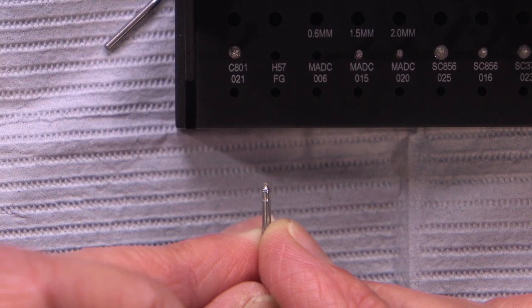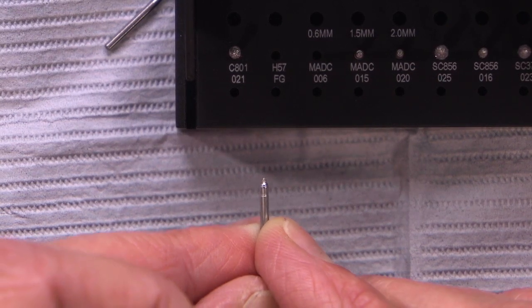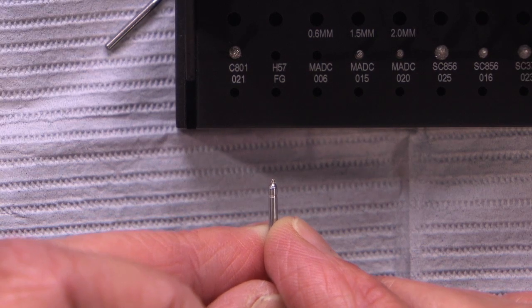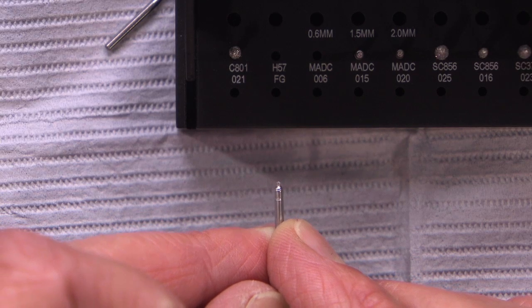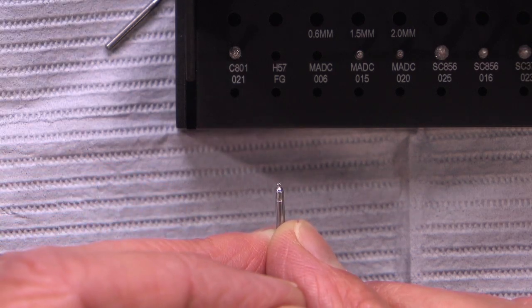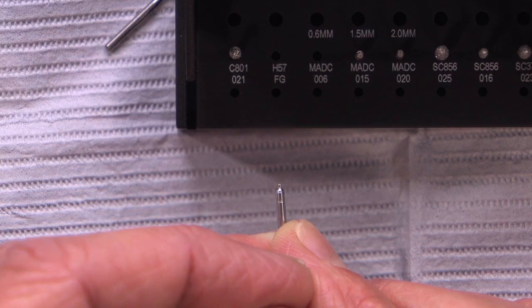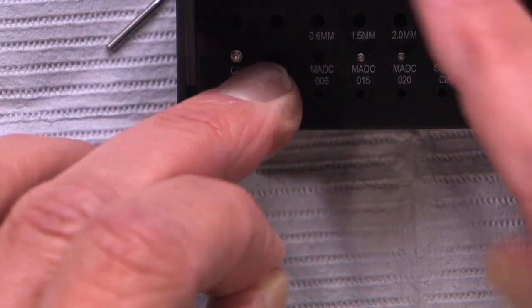So if I'm doing a Bruxer crown on a lower second molar, I'll use this burr to put a depth cut on both lingual cusps and then two in the central groove, maybe even the buccal cusp too, because on a second molar that can be difficult to see. And then I'll prep the occlusal surface till I can't see those depth cuts anymore. And then I know I have at least 6/10 of a millimeter reduction, probably 7/10 by that point. And so I've got enough for a Bruxer crown, but if I still need to adjust the bite, I'm going to have to do it on the opposing tooth. We don't want Bruxer to get any thinner than that.